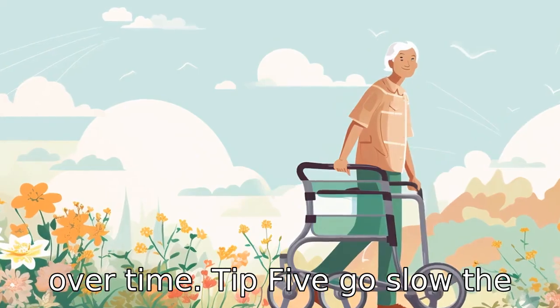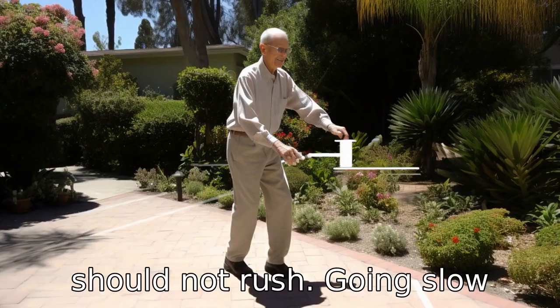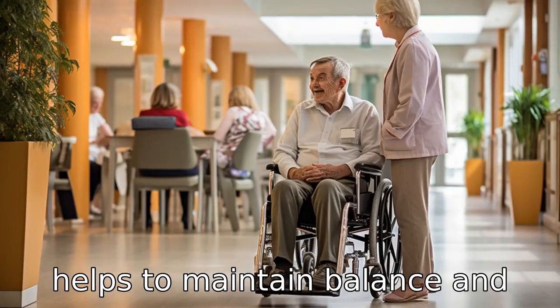Tip 5: Go slow. The person using the upright walker should not rush. Going slow helps to maintain balance and prevent falls.